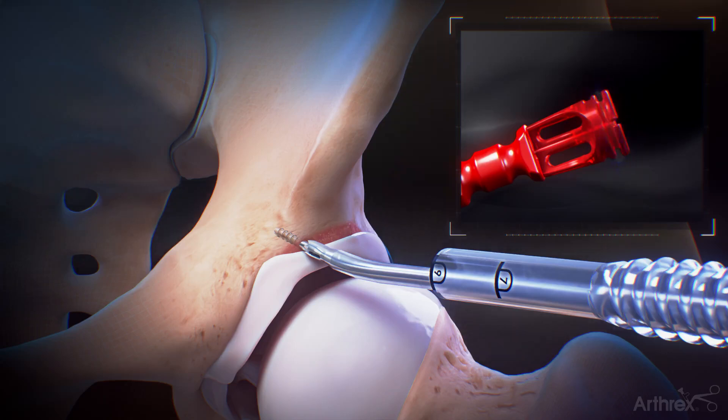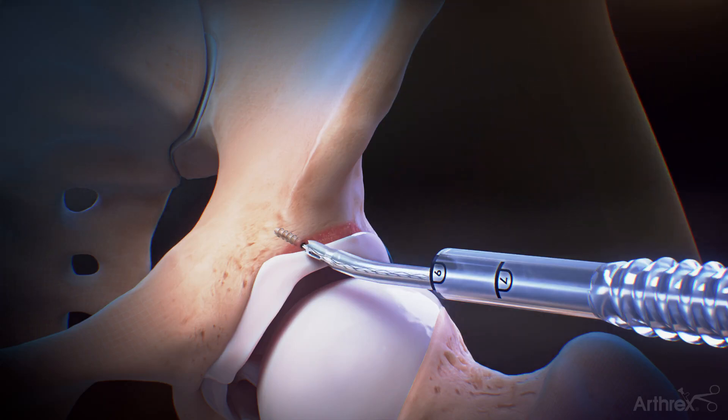Remove the suture release tab. Remove the drill guide and anchor inserter from the cannula.